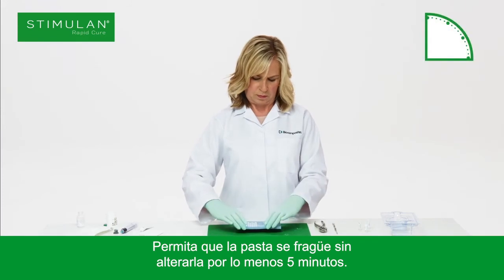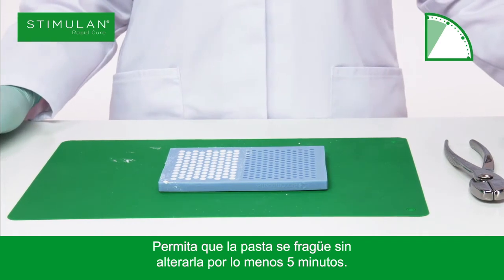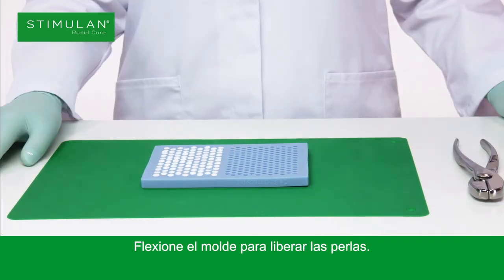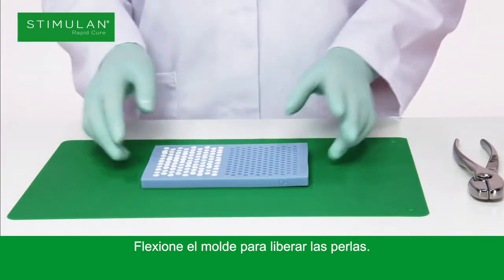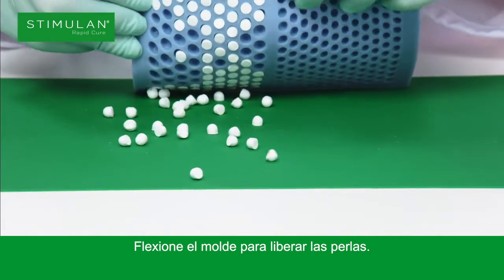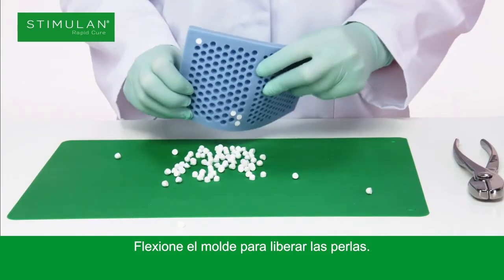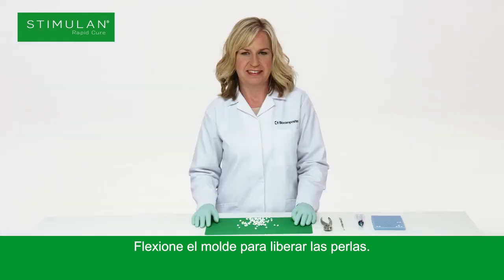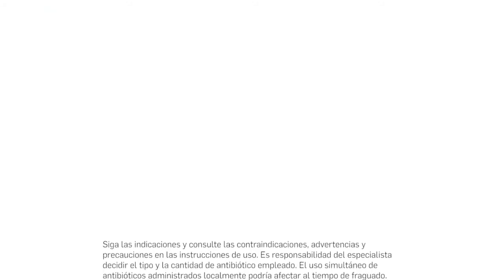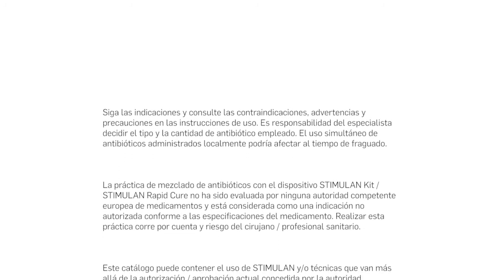Allow the paste to set undisturbed for at least 5 minutes. Flex the bead mat to release the beads.